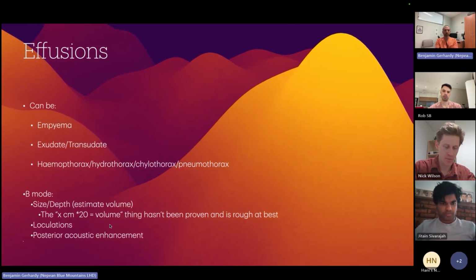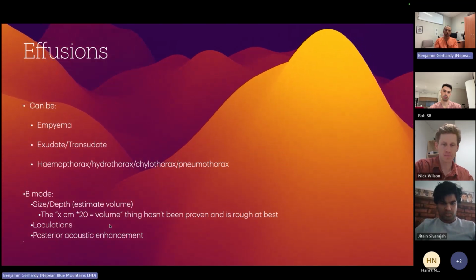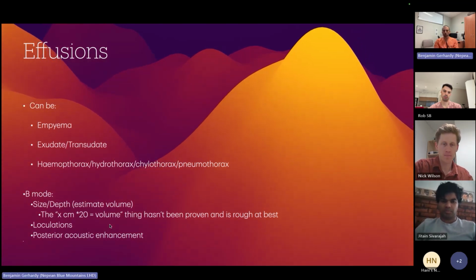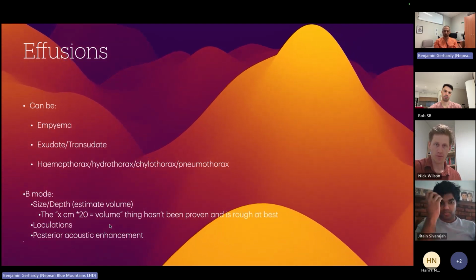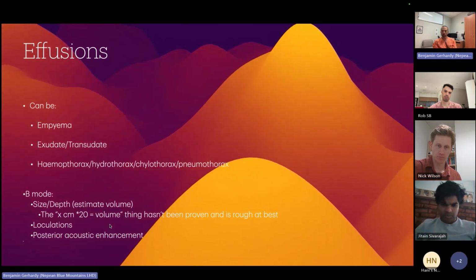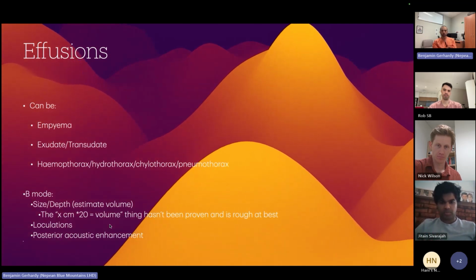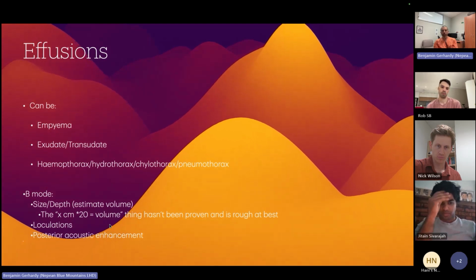It's sort of urothorax. What I didn't go through before was gauging its size, or if it's small or medium or large. And you see a CT report come out saying a small or a large pleural effusion. I don't know by what parameters radiologists define things as being small, medium, or large, but certainly on a CT, things can look a lot bigger than what they are under ultrasound.